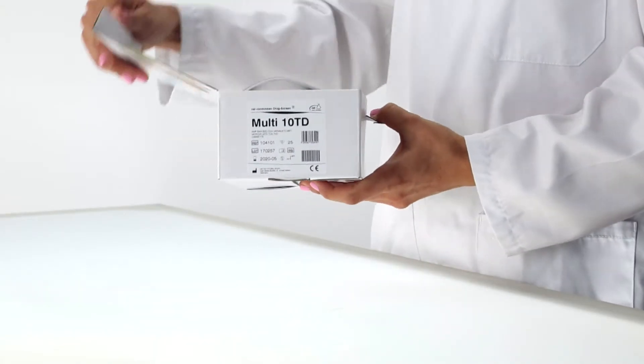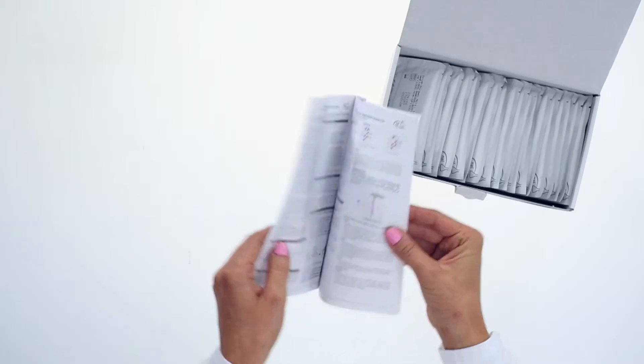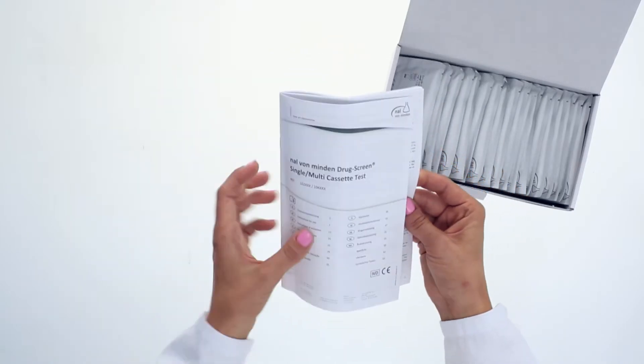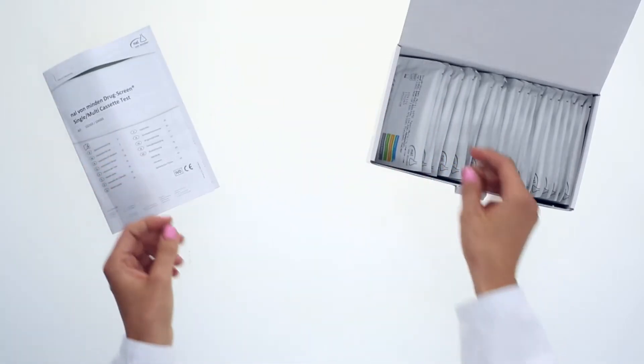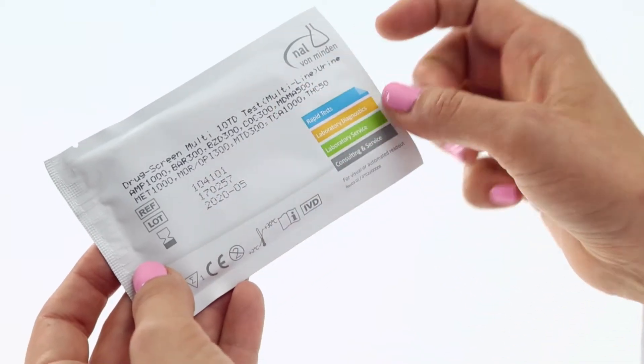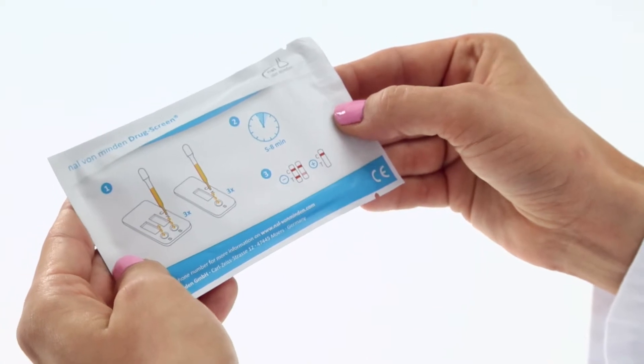All Nal von Minden drug screen rapid tests are based on the same test principle. Always start by reading through the instructions carefully. Do not use tests with damaged pouches or beyond the stated expiry date. You can also find brief instructions on the pouch.